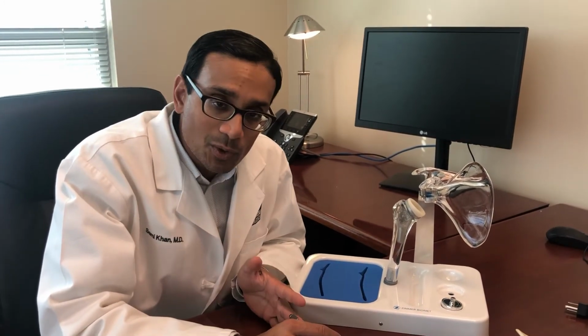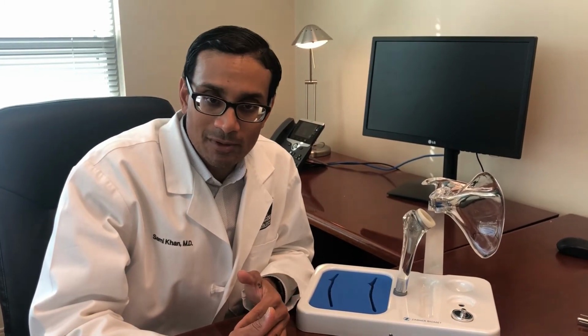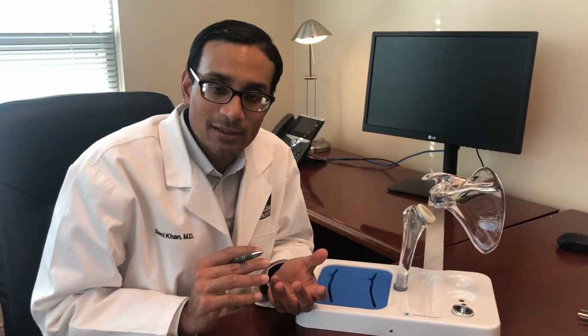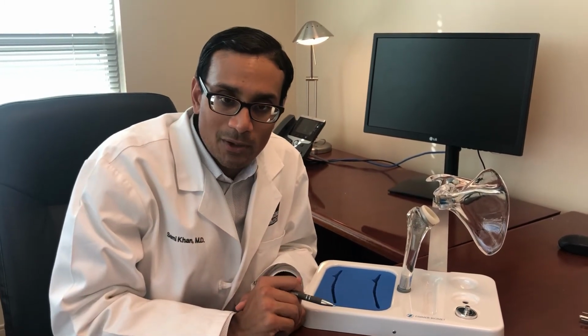The second type of shoulder replacement is for someone who has bad arthritis as well as bad rotator cuff injuries, severe rotator cuff tears. In this situation, we do reverse shoulder replacement where we flip the ball and socket around to let the deltoid muscle be the workhorse for the arm.